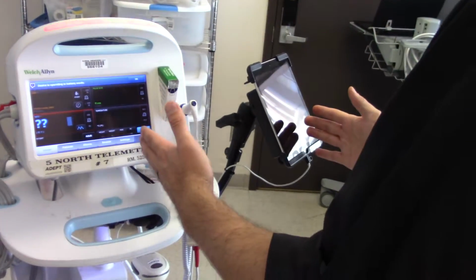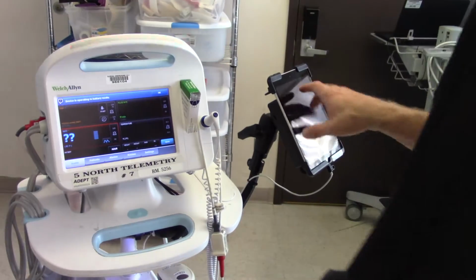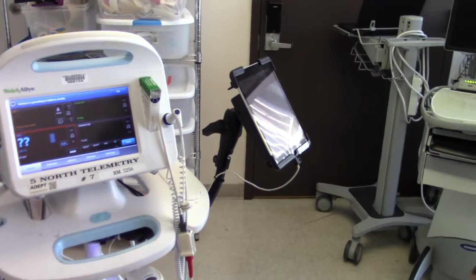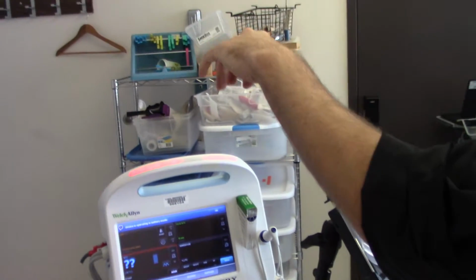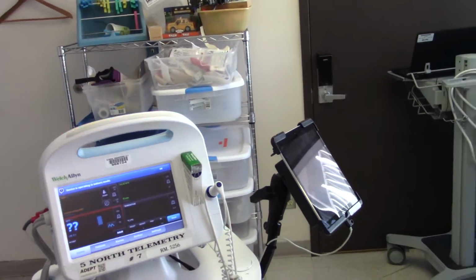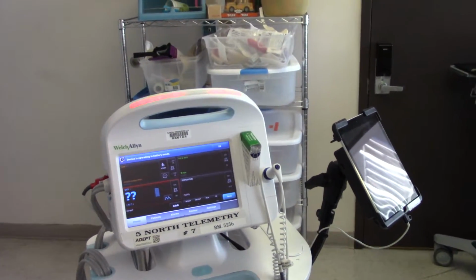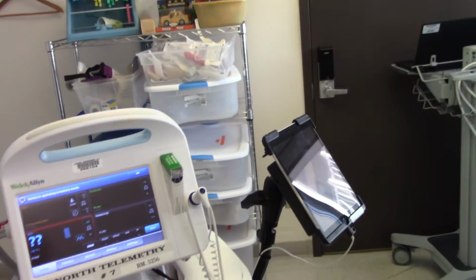So if you look where it is now, I can keep my hand at about a right angle, keep my wrist pretty straight while I'm working on the device. Great, that eliminates repetitive stress, and that's something to think about. But if you're going above your head, your wrist will be bent. It's gonna be more problematic. Exactly, and so that's just something we have to consider with these things. I only know that because we've run into these issues setting up workstations. No, I appreciate your knowledge.